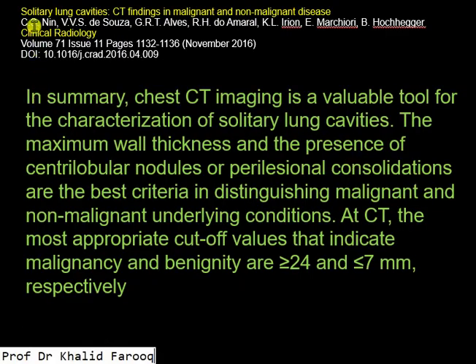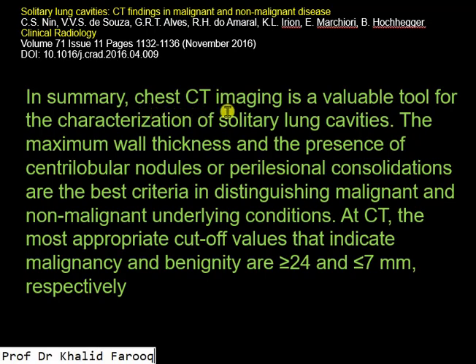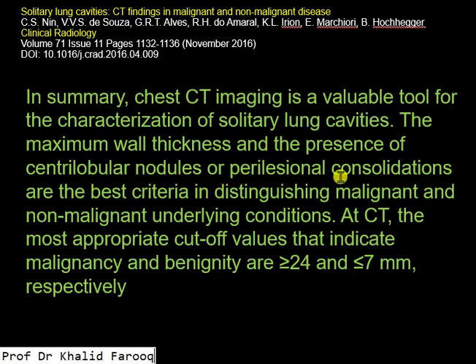These are features noted in benign lesions such as tuberculosis. We have reviewed an article in Clinical Radiology: 'Solitary lung cavities — CT findings in malignant and non-malignant diseases.' The summary states that CT chest images are a valuable tool for characterization of solitary lung cavities, and the maximum wall thickness and presence of centrilobular nodules or perilesional consolidations are the best criteria for distinguishing malignant from non-malignant conditions.